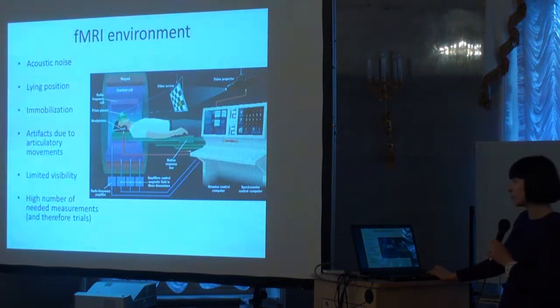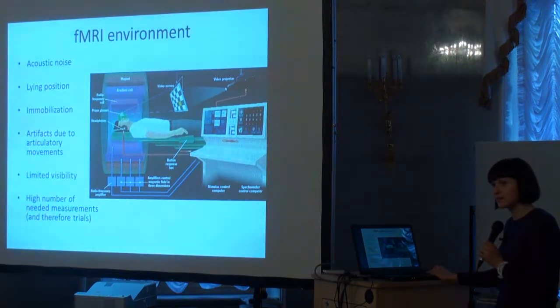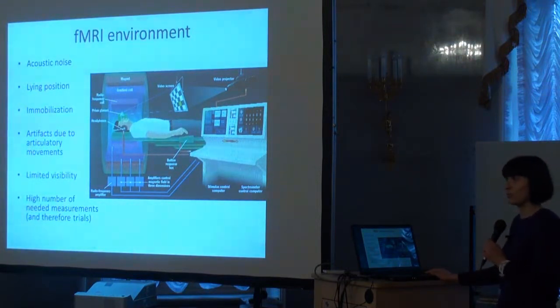And we need a high number of measurements to get statistically robust results. And therefore, we need many trials, but the length of the experiment, of course, is limited. It is impossible to keep a healthy person in the scanner more than an hour, usually. It's because there is no attention in the end, and you don't know what you measure.